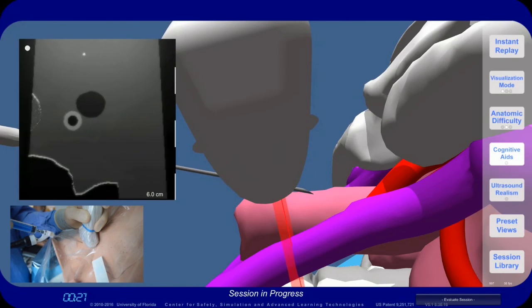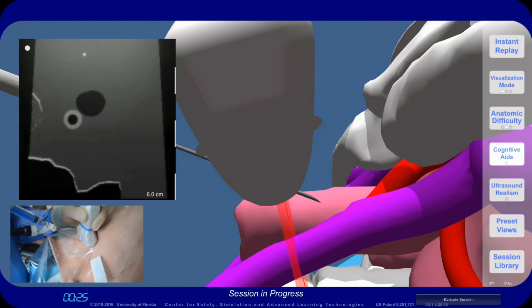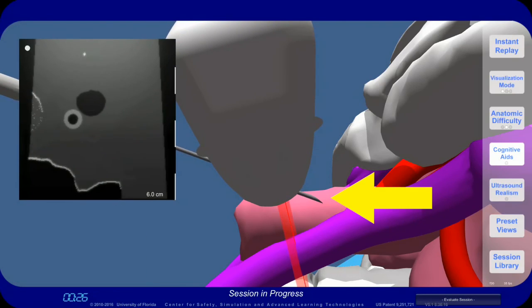Looking from this view, you can see that the needle is shown in the ultrasound image; however, when you take a closer look, you can see that the needle tip is actually far beyond the ultrasound beam. In the ultrasound image, you are actually looking at the shaft of the needle rather than the needle tip.